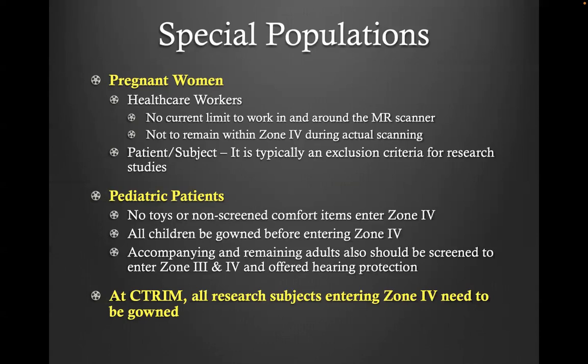So they will need to change out of their clothes and take off all their jewelry and rings and everything. The best thing you can do is, when you ask your subject to come for an MRI, ask them to take off all jewelry and any piercings. Sometimes it can be really hard to remove and take excessive time. And also ask them to wear comfortable clothes, and they will need to change to gowns anyway here.